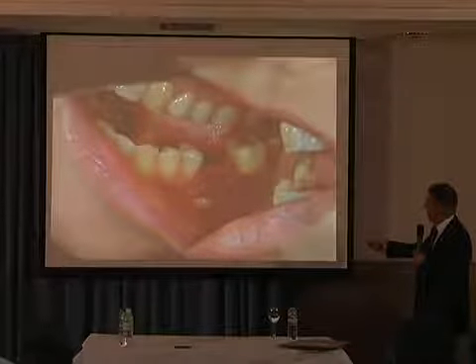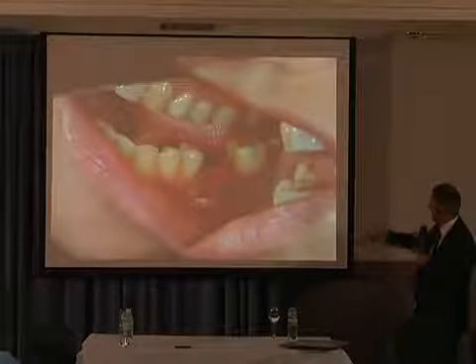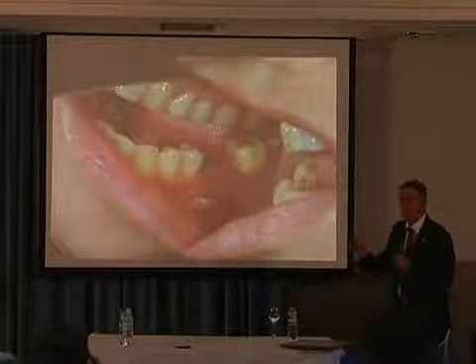7 days later. This is in the mirror. Yes, you see here the mirror. And you see a very nice soft tissue healing because of the PRGF, of the fibrin effect.